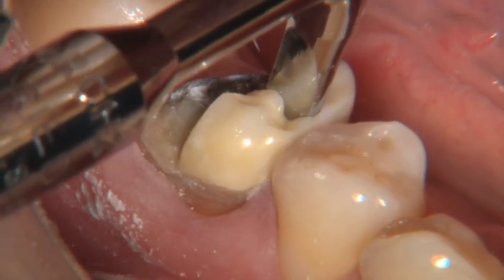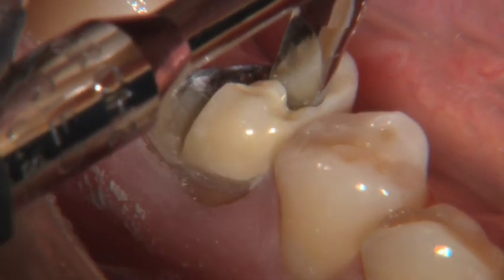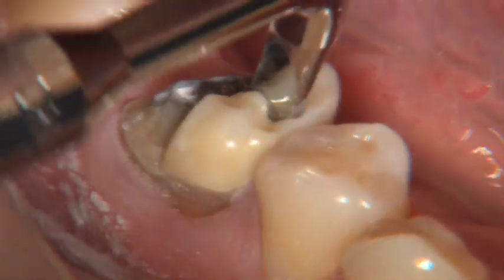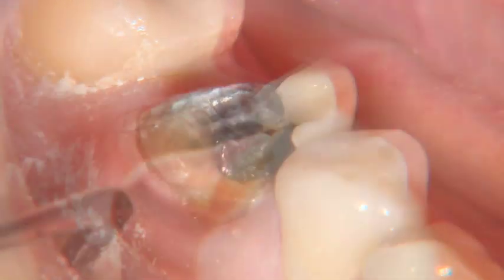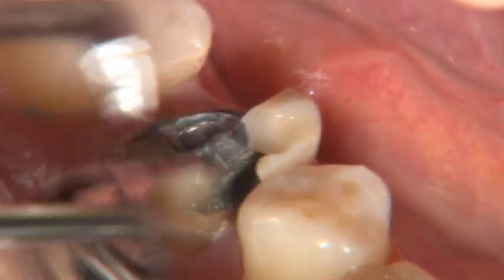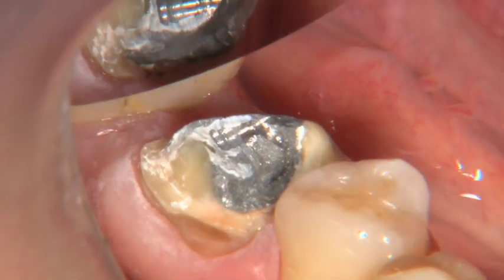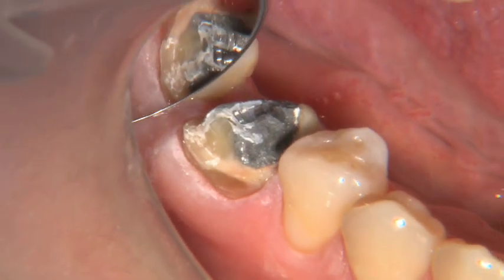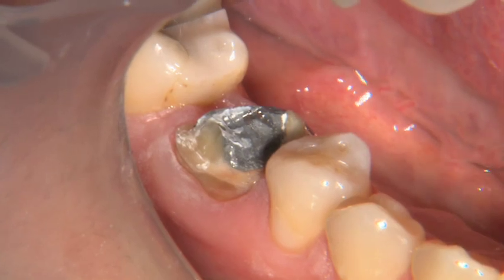So we took off the first one. Now I'm going to crack through the mesial marginal ridge and separate the lingual and buccal portions. And there goes the mesial buccal portion of the crown coming off. Usually you would have to cut this in half one more time, but I get lucky here — the vibration from the handpiece has broken the cement bond so I can actually pull this mesial lingual piece off. Usually you would have to cut that in half again and then maybe even prep off the last little eighth of crown from the tooth.